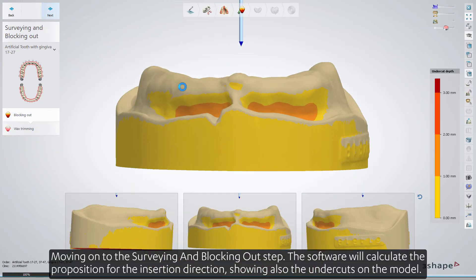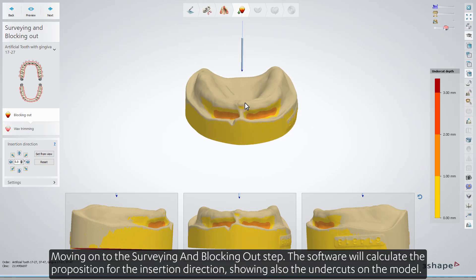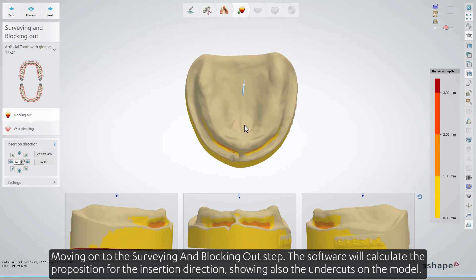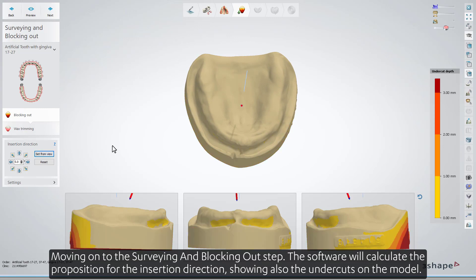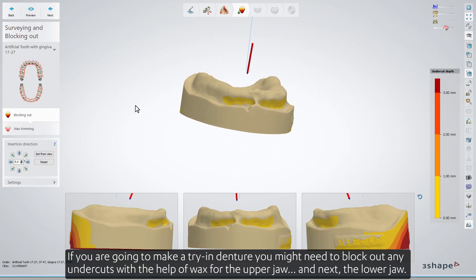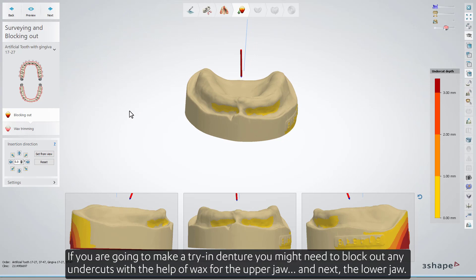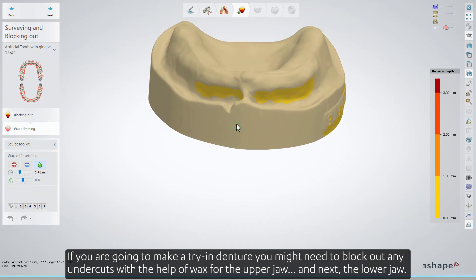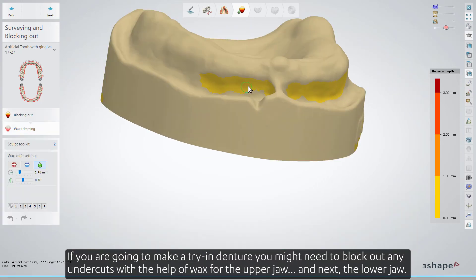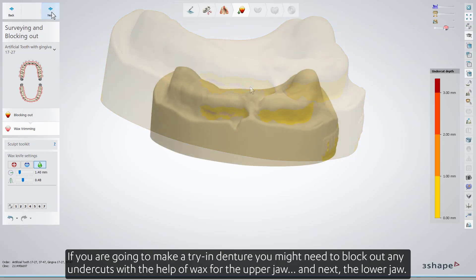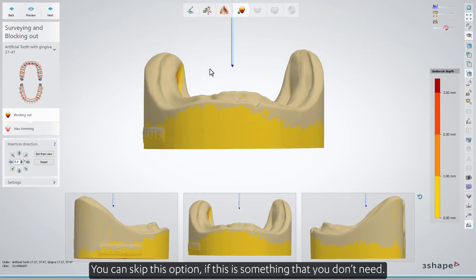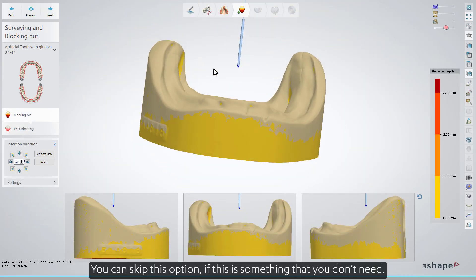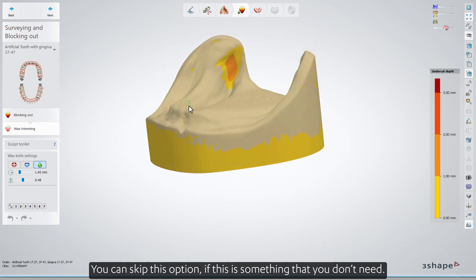Moving on to the surveying and blocking out step. The software will calculate the proposition for the insertion direction, showing also the undercuts on the model. If you're going to make a try-in denture, you might need to block out any undercuts with the help of wax, for the upper jaw and next the lower jaw. You can skip this option if this is something that you don't need.